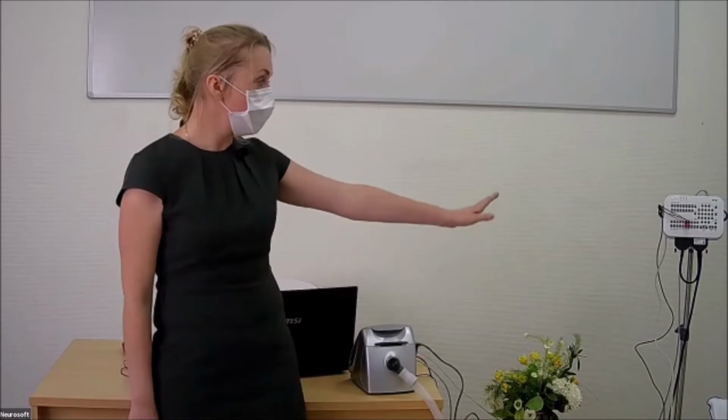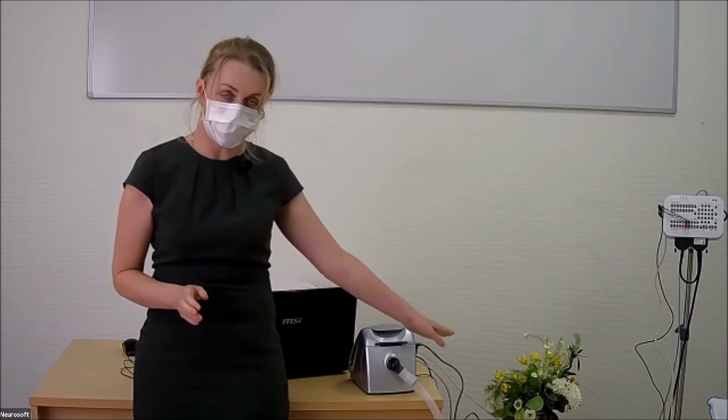But if we'd like to use such a module, we need a system which includes several DC channels, and in our case, it is Neuron-Spectrum-65. So it means that we can't use the Neuron-Spectrum-AM when we use this module. So this is some limitation of the Neuron-Spectrum-AM system. But now we will use this system.